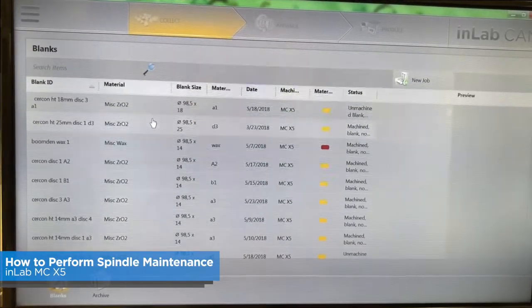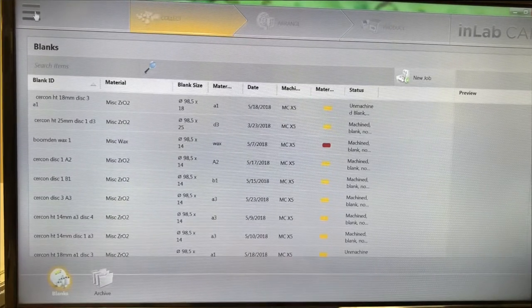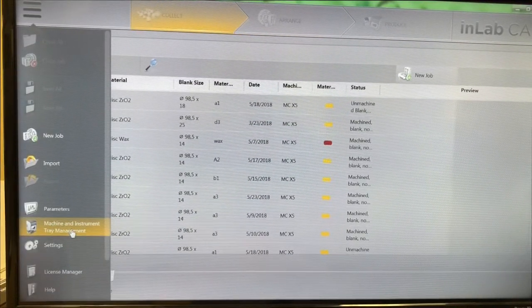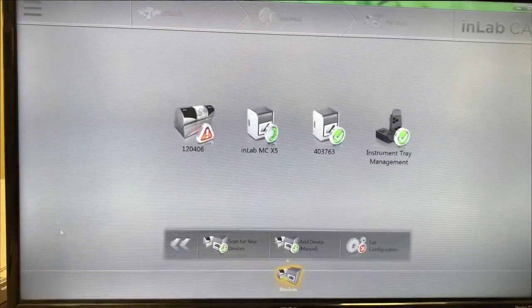First thing you need to do is open up your CAM software, go to the upper left hand corner, click on the three bars, go down to Machine Instruments and Tray Management, and click that.